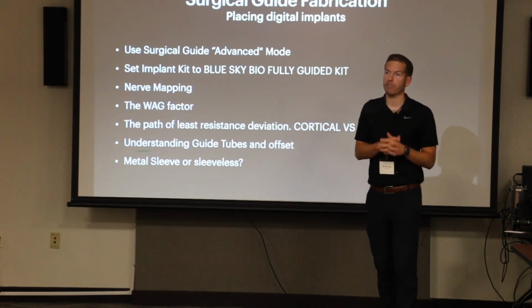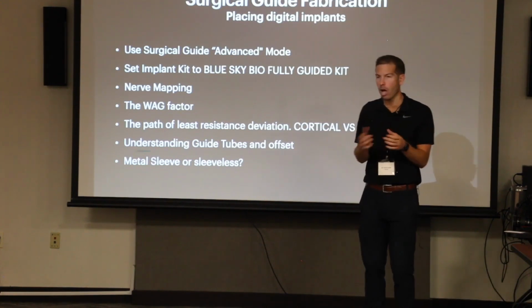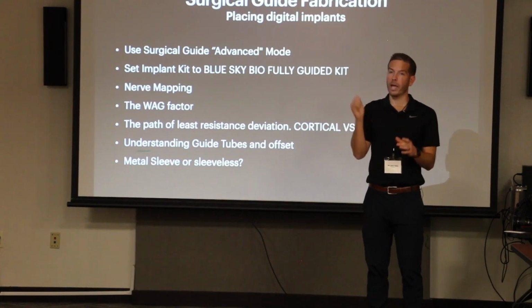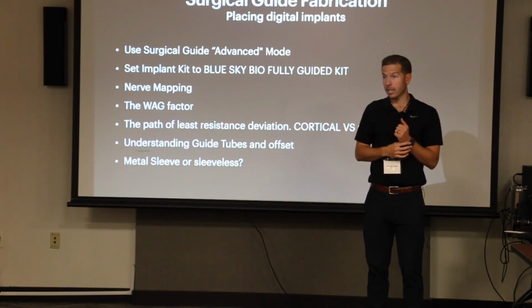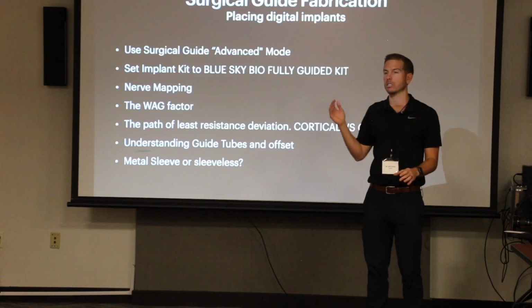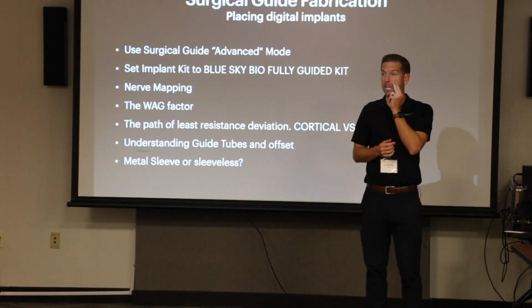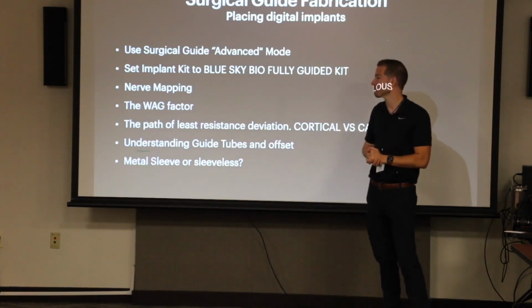Now, if you're talking about friction and heat, and considerable heat, this is how long the drill should be in there. So quick pumping motions with copious irrigation, and in my hand it hasn't led to any considerable heat that I've noticed to be an issue, like toast in the bone basically. It should be quick pumping motions, just like all our osteotomies, with copious irrigation, and that should minimize it. I haven't experienced that to be an issue, but I've heard that come up before.